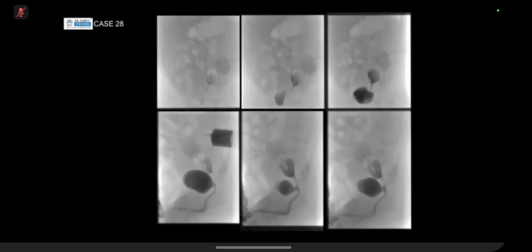The tube is going into the bowel. Yes, I think it's bowel. Okay, so what we've done on these images is something called a distal loopogram. With anorectal malformation children, they get defunctioned because they don't have a way to pass their feces. So they get a stoma made, and then they have a distal mucus fistula, which for the ARMs is normally quite low, in the region of the rectum or the sigmoid colon. And what we've done here is put the catheter into that distal part of the defunctioned bowel, and we're injecting contrast through.